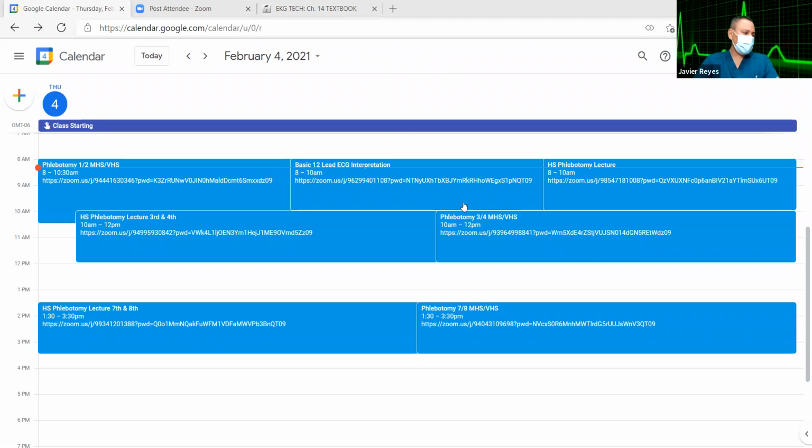And so when somebody has a STEMI, ST segment elevation myocardial infarction, that's your typical classical heart attack. That's what people show in the EKG when they have a heart attack. It's the most common. So you have not only your ST elevation or depression, but you have T wave inversion. The T wave can be upside down or inverted, and develop a pathologic Q wave.